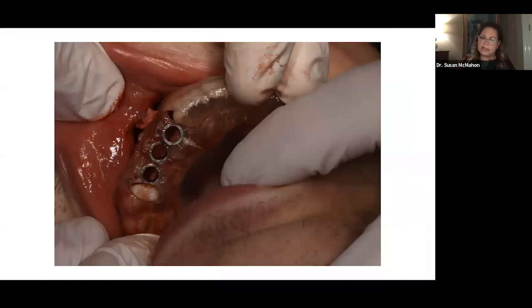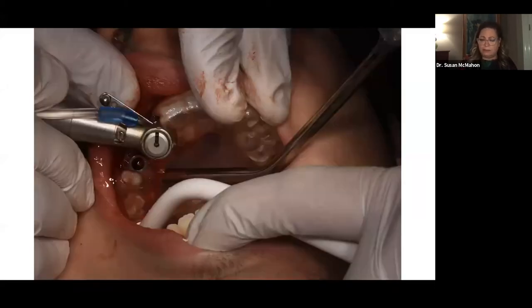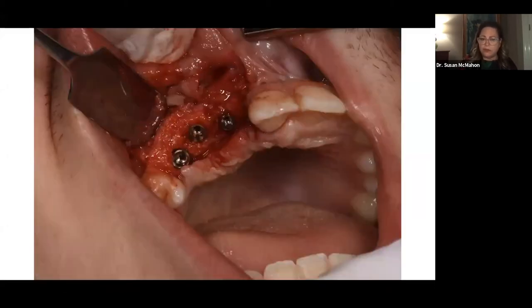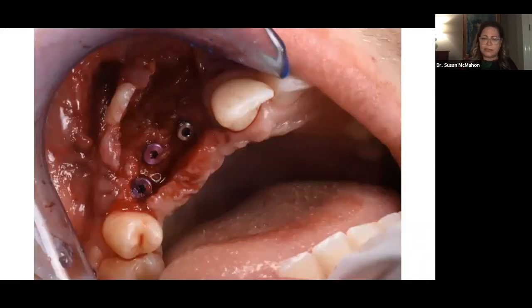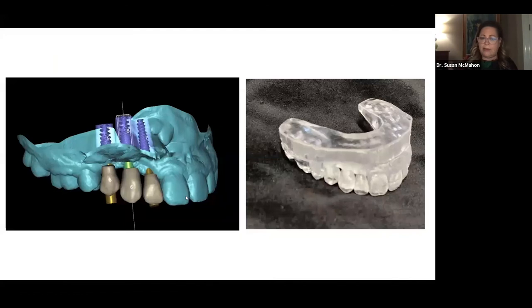So here's this guy's surgery. We're ready to go. He's got 3 implant sleeves in there on this guide that we've printed in our office. Consultation to surgery is a couple of days. We're using the guide with the calipers in there, drilling the holes, putting the implants in. There they are, suturing them up, allow him to heal for a while.